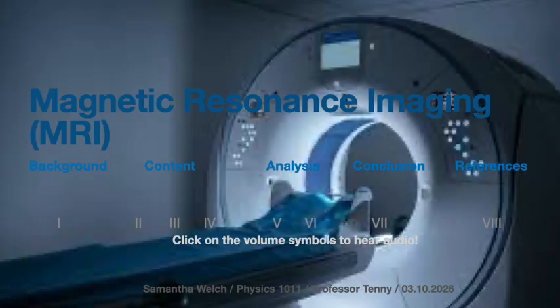The next section goes into MRI safety and pregnancy. MRI imaging uses those magnetic fields and the radio frequency energy rather than ionizing radiation. The ionizing radiation is used in X-rays and CT scans, which damage DNA and potentially increase the risk of cancer when exposure is repeated. Because MRI relies on magnets rather than radiation, it is generally considered safer for repeated imaging.